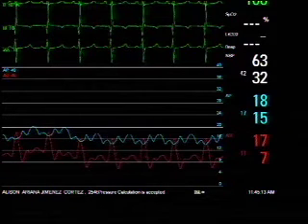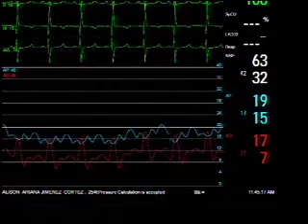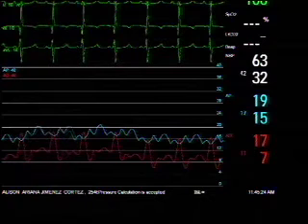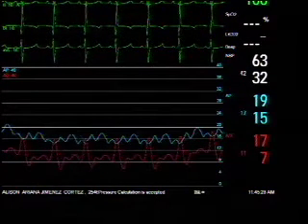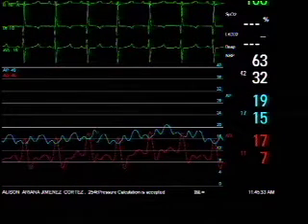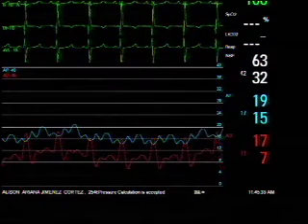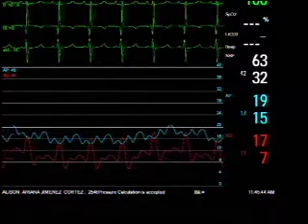The pressure at the left superior vena cava is about 17, the mean pressure, and the red pressures are in the left atrium. I passed the catheter there, so these are left atrial pressures. So our first surprise is that the pressures are pretty normal.